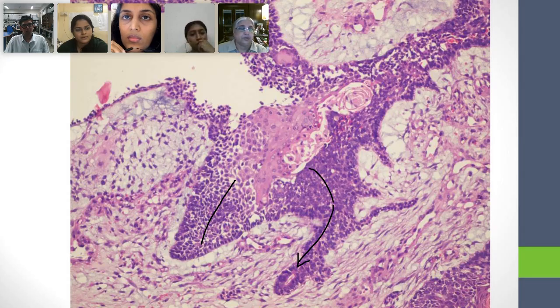Anybody wants to disagree, Neelam? Agree, disagree, whatever. Ma'am, I disagree because I don't think this is the normal epithelium at all. All the cells are part of the tumor. So is there dysplasia? Then tell her. All these are tumor cells according to me. So I don't think the tumor cells can be dysplastic or not?